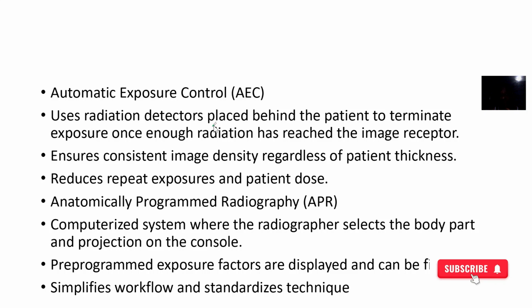This one uses radiation detectors, usually placed behind the patient. While imaging, when anything is out of proportion, they stop the exposure automatically.